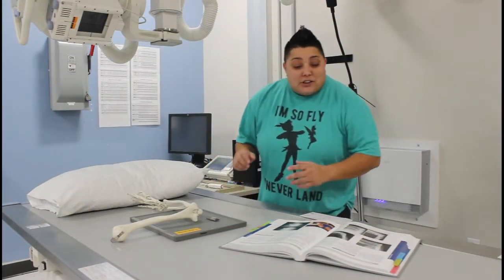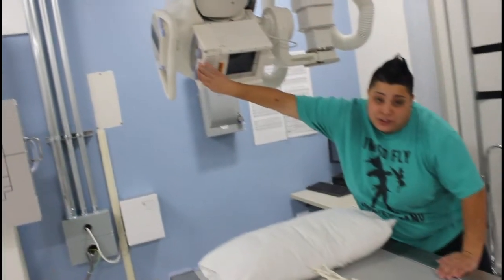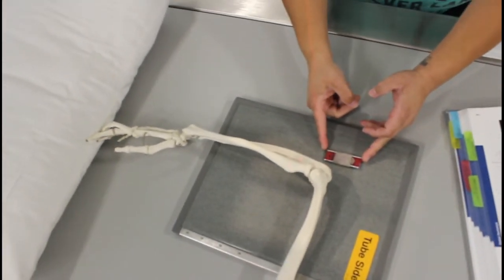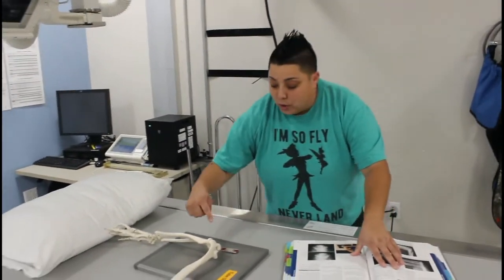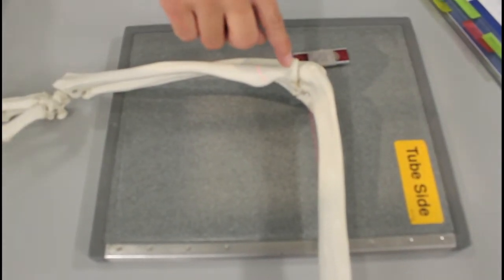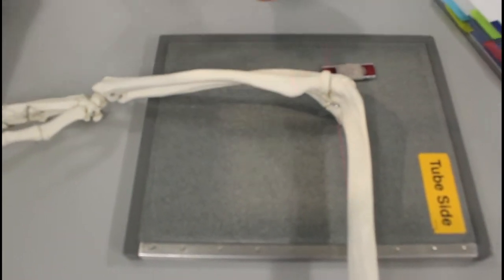And we're back. So now I'm going to explain the evaluation criteria for the radial head with the Coyle method. So the first thing you want to be sure is that you have proper collimation, which is 6 by 6. The other thing you want to be sure of is that you have the proper marker placement, clear of any anatomy of interest. The next thing you want to have is open joint spaces between the radial head and the capitulum. Next thing you want to be sure you see is the radial head, the neck, the tuberosity in profile, free of any superimposition.